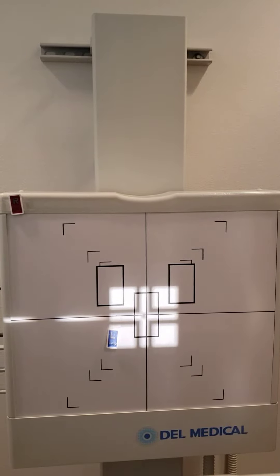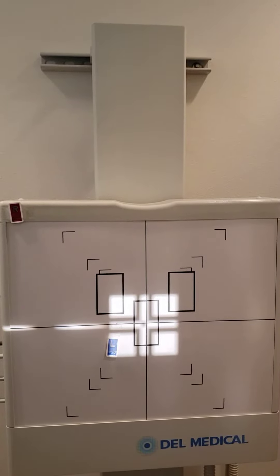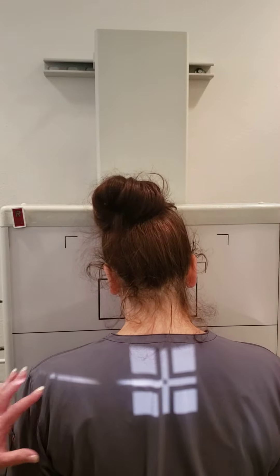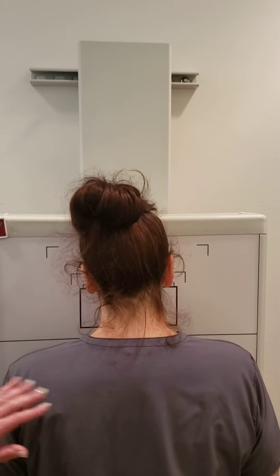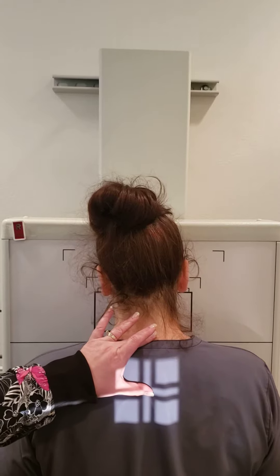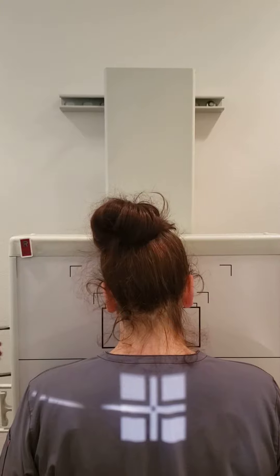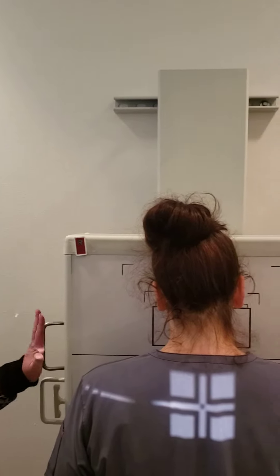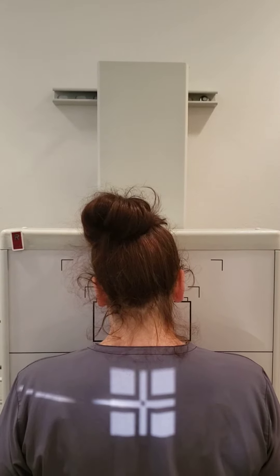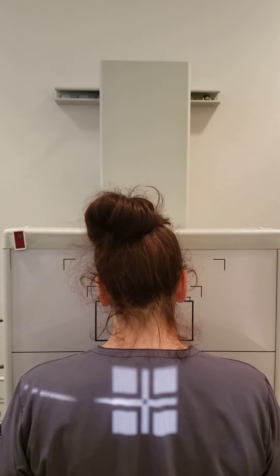We're going to go about three to four inches inferior to C7 to get our central ray. We're going to bring our lead shield in behind you. Stand up nice and tall, all the way forward. I'm going to palpate for C7, go down about three to four inches. We just want to make sure the patient is straight and aligned. Go ahead and take a breath in, blow that breath out and hold your breath out. We'll expose and you can breathe.